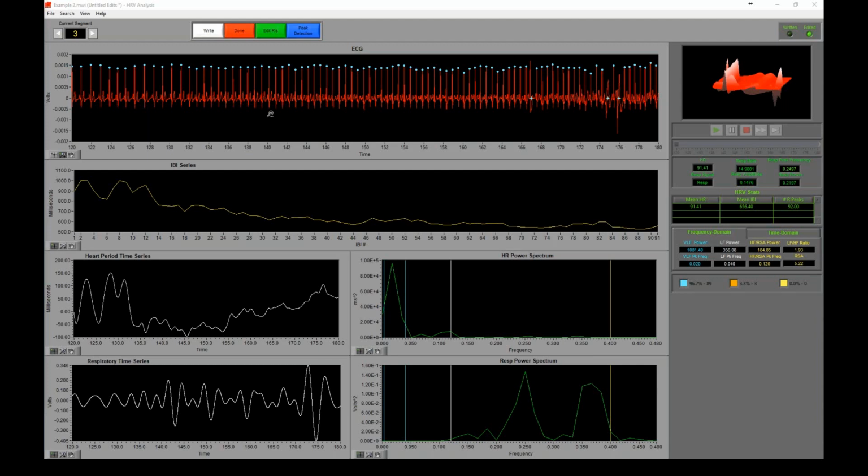And when you have to discard a segment, hopefully that is one segment within a larger analysis period. So let's say you're looking at a 10-minute baseline and you have 2 segments that you need to discard. You can take the average representation of those other 8 minutes as indicative of your baseline and still end up with values to compare to later down the road. So that would be the appropriate approach there.